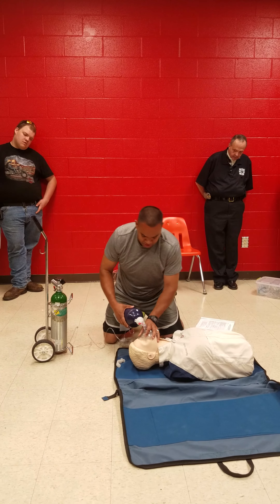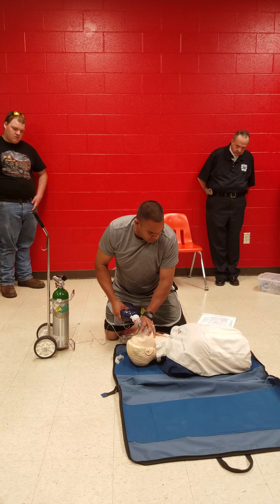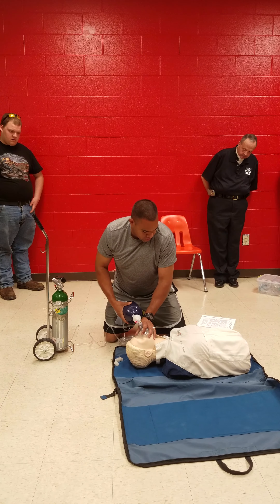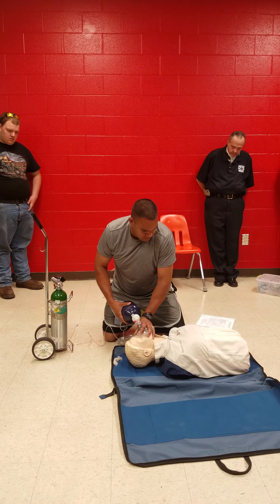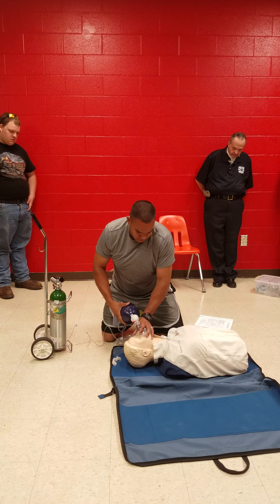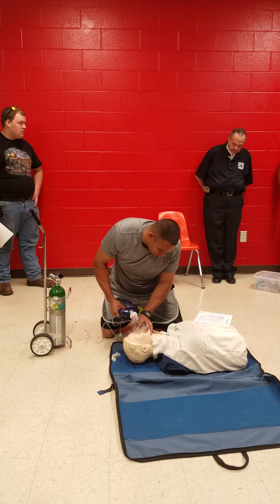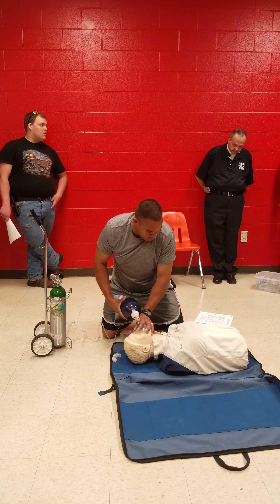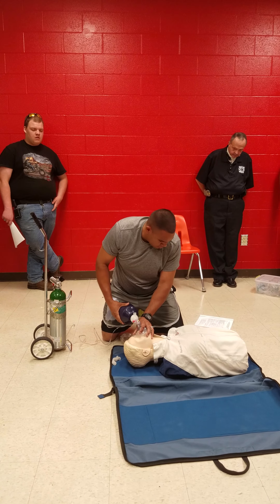Rotate it to the back of the throat. Now at this point your 30 seconds of ventilation will start. The evaluator will start the 30-second clock. After that clock reaches 30, he's going to say second rescuer is on scene.